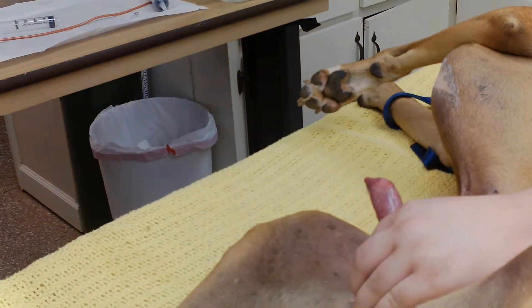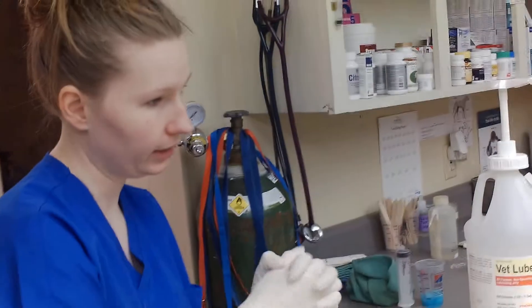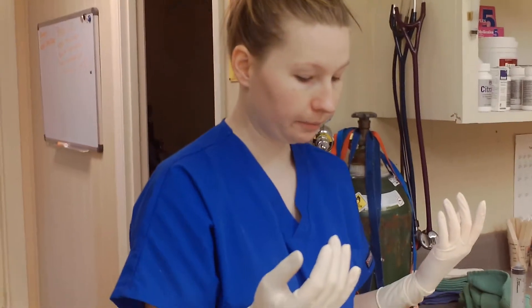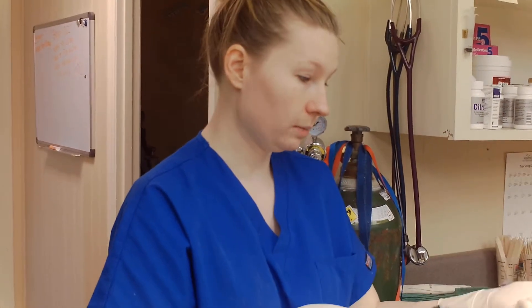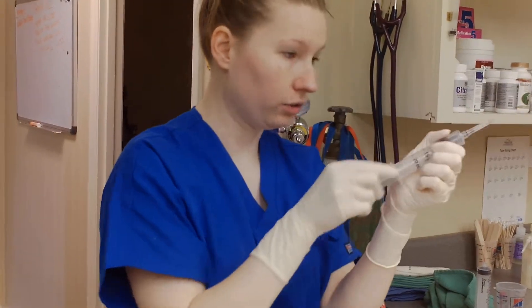At this point we already have him cleaned up and ready to go. If the reason we were catheterizing him is due to a urinary blockage — whether it be a crystal or stone — we would take our syringe full of saline, and I would have somebody hold the bag for me so that I can take the syringe, attach the needle, stick it into the bag, and draw out my saline.